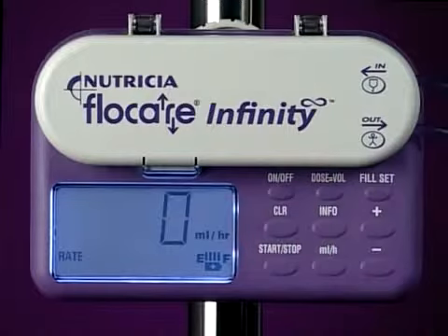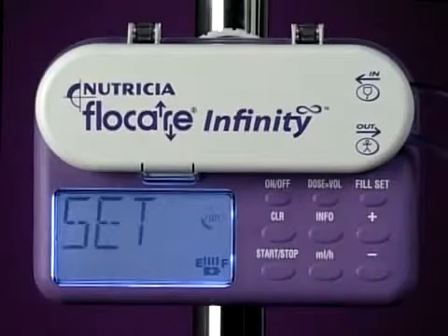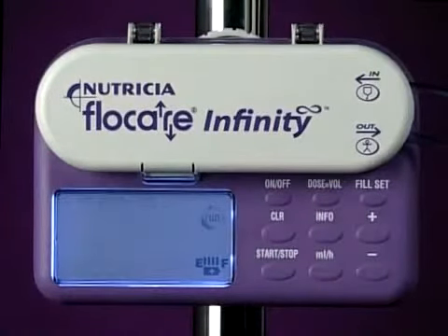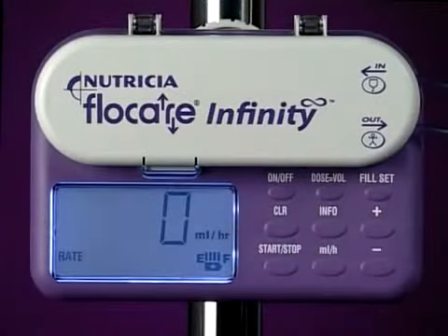Before that, however, we need to prime the set. To do this, press and hold the fill set key. After two seconds the pump will beep. Release the key and the line will automatically fill with feed. The pump then returns to hold mode.